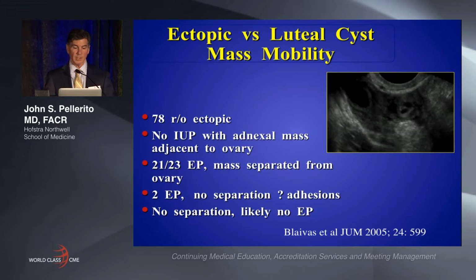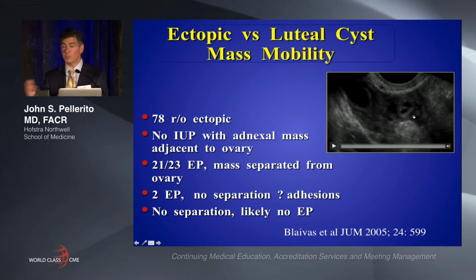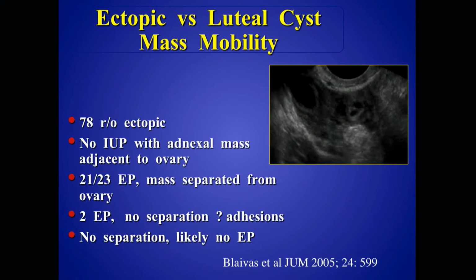Finally, just a point about mobility. Now, many times, and here's a good example. Here's the ovary, and here's this little lesion right next to it. Is it part of the ovary, or is it separate from the ovary?